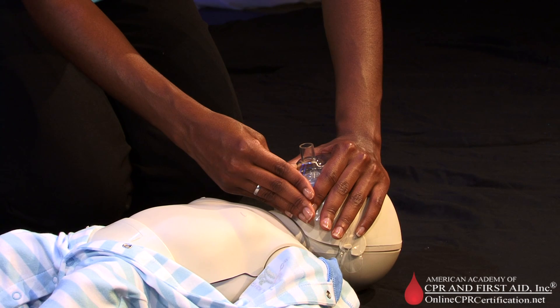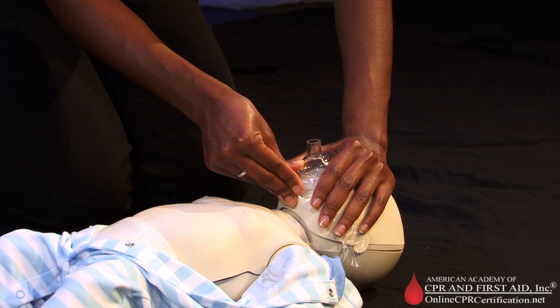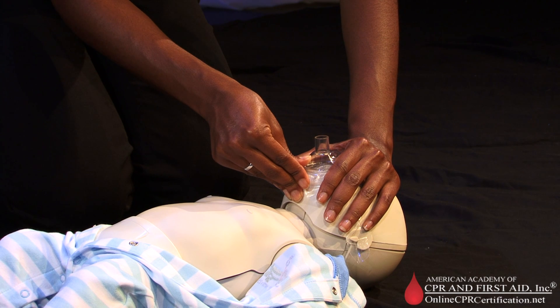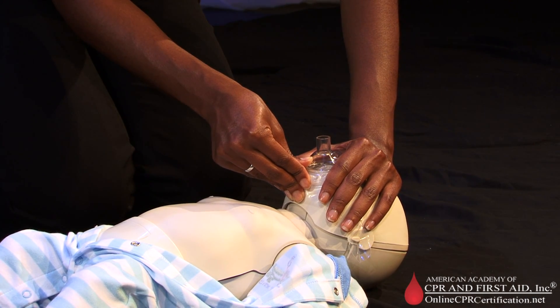Use the remaining fingers of your second hand along the bony margin of the jaw and lift the jaw. Perform a head tilt chin lift to open the airway. Keep the head in a neutral position, because if you extend an infant's head beyond the neutral position, the infant's airway may become blocked.